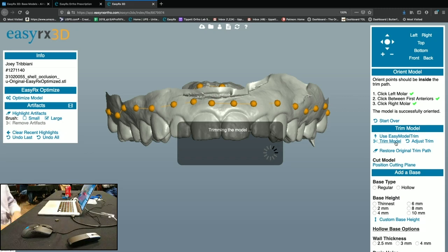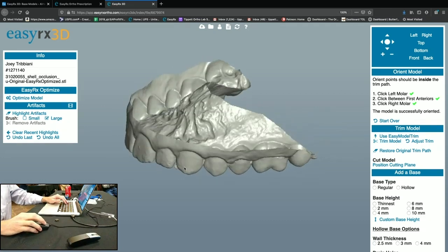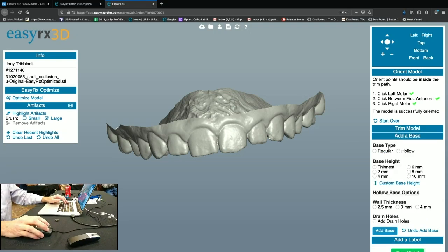And now this is all happening on their server, so they're kind of telling you what they're doing. So then it's trimmed, and you can check it, make sure it's good. And so then after your trim, you can just keep going down. You can click these to collapse.